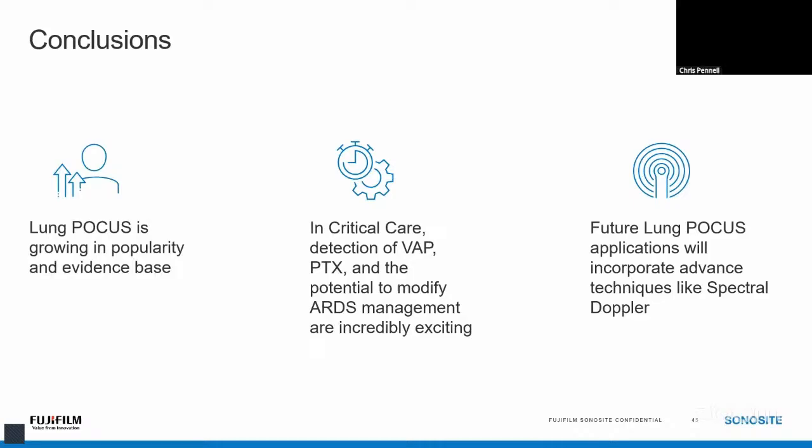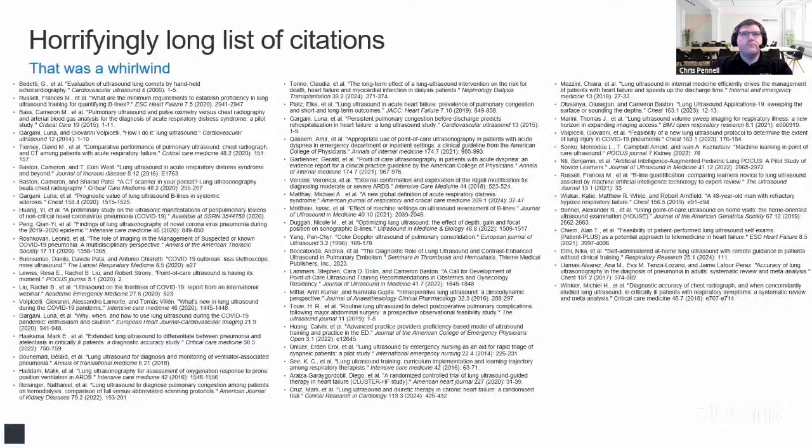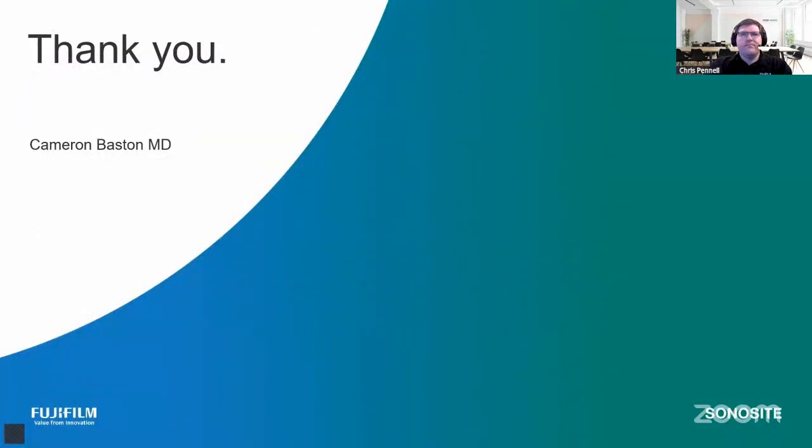Thank you so much. As we conclude, lung ultrasound is growing in popularity. The evidence base is exploding. In critical care, our ability to detect ventilator-associated pneumonia, pneumothorax, and modify our ARDS management is incredibly exciting, and the future of lung ultrasound is going to incorporate a lot of new techniques. Here are some citations. That was a bit of a whirlwind of evidence review. Thank you so much. I'm excited to talk to you about questions.